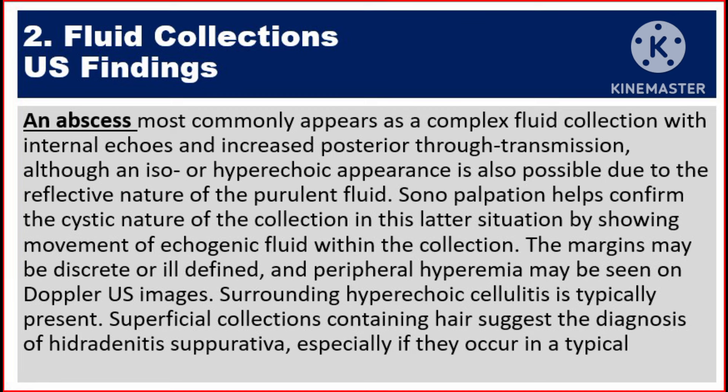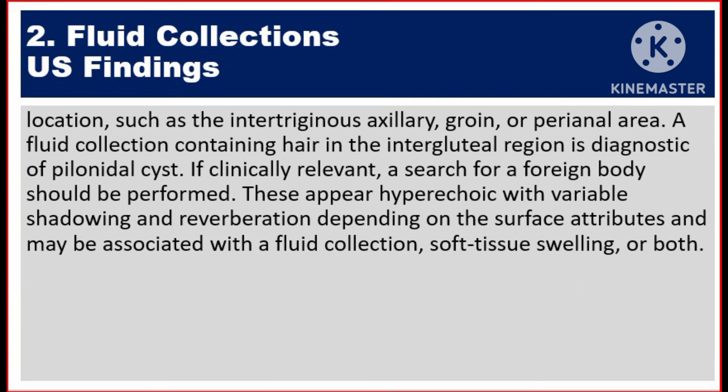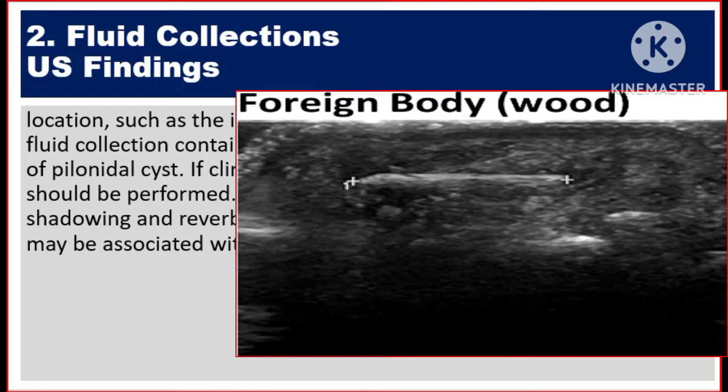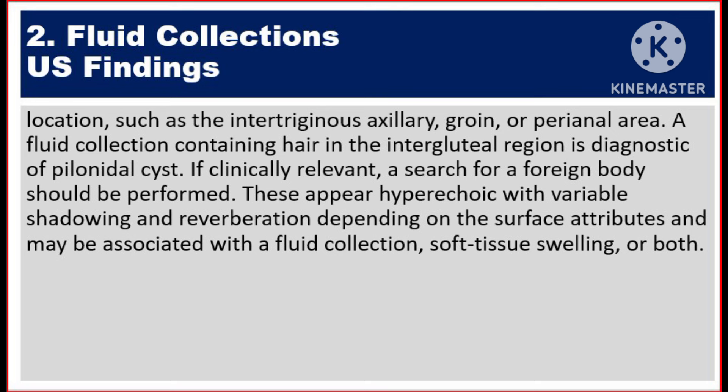Surrounding hyper-echoic cellulitis is typically present. Superficial collections containing hair suggest the diagnosis of hidradenitis suppurativa, especially if they occur in a typical location such as the intertriginous axillary, groin, or perianal area. A fluid collection containing hair in the intergluteal region is diagnostic of pilonidal cysts. If clinically relevant, a search for a foreign body should be performed. These appear hyper-echoic with variable shadowing and reverberation depending on the surface attributes, and may be associated with a fluid collection, soft tissue swelling, or both.